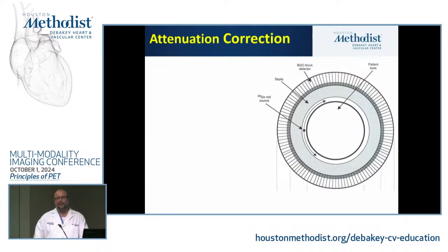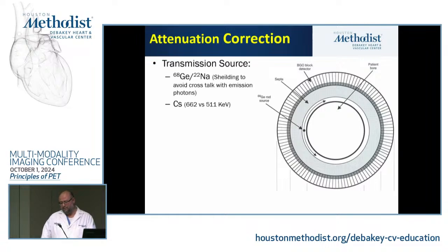So how do we do attenuation correction? There are three ways. The old way was before the advent of PET-CT. It was more on the PET system. There was a PET, and in front of it, there was a radioactive source, so while you're doing the PET, the patient was getting another radiation from a source that was rotating around the patient. So the patient is getting irradiated twice, one from inside and one from that source. And then they create mu maps for these.